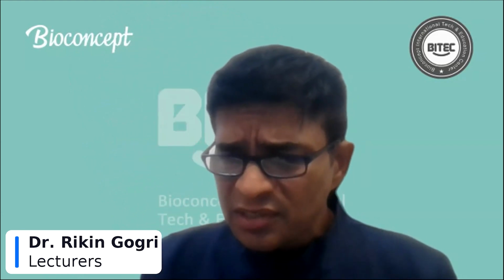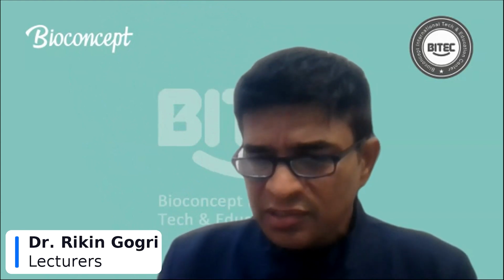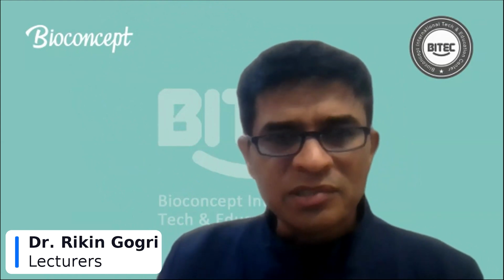The last question is, in China, we usually use multi-units for full edentulous restorations. That is the all-on-4 or all-on-6 with the metal bridge. Can you share how you use multi-units in India? Is it the same as us? Yes, doctors, it is more or less the same.